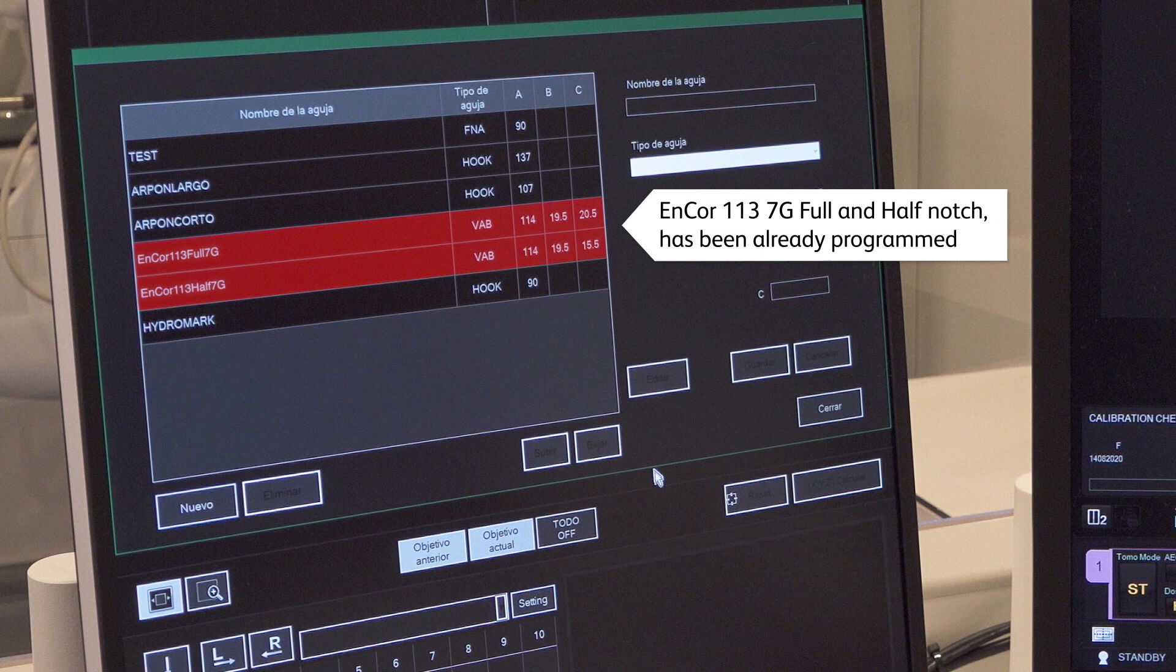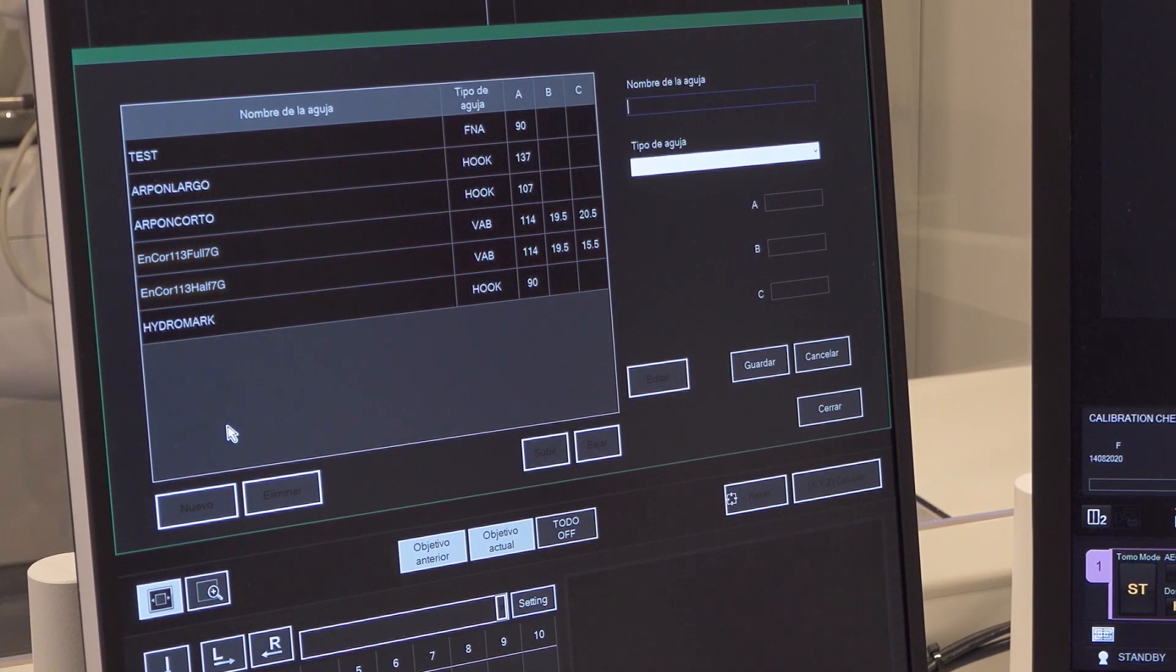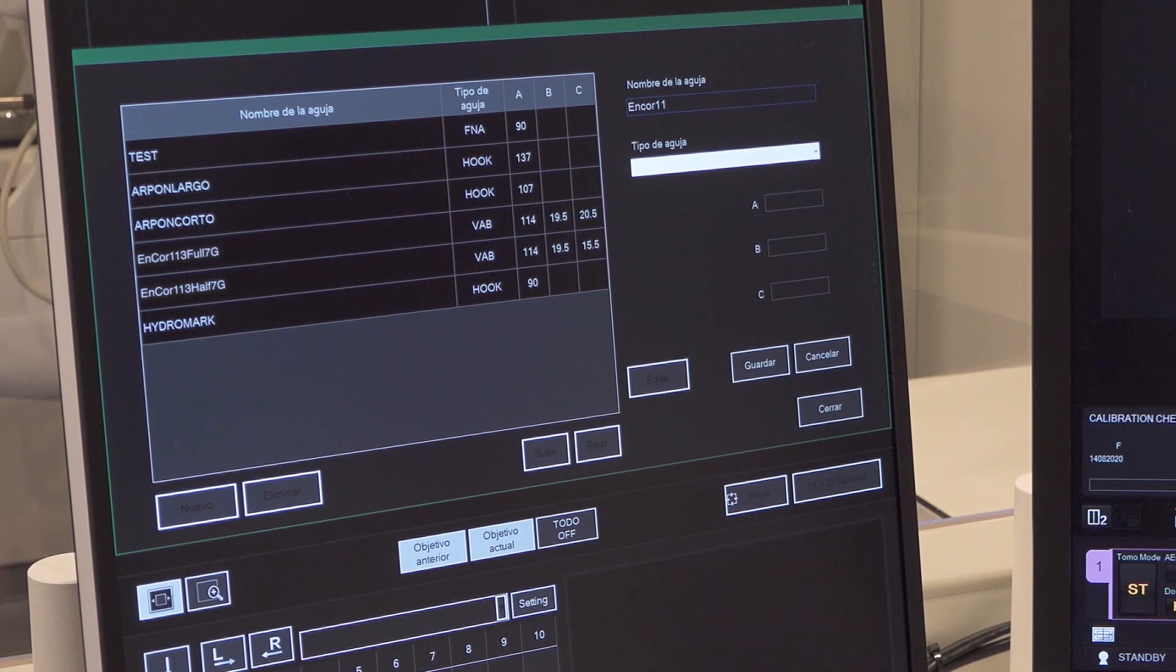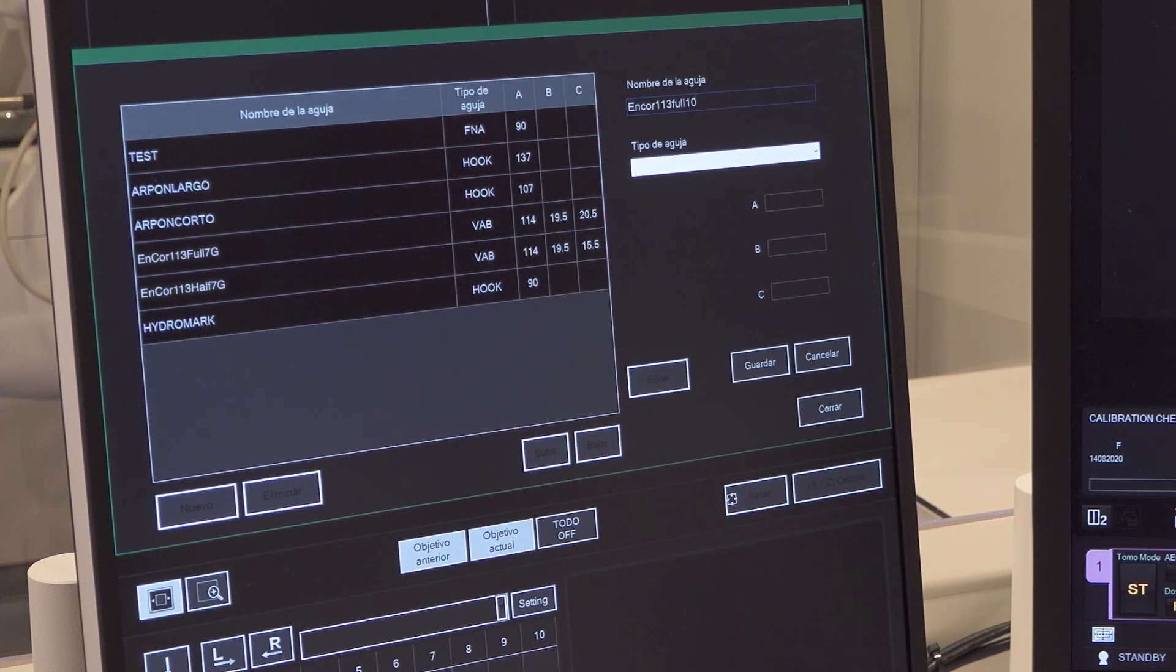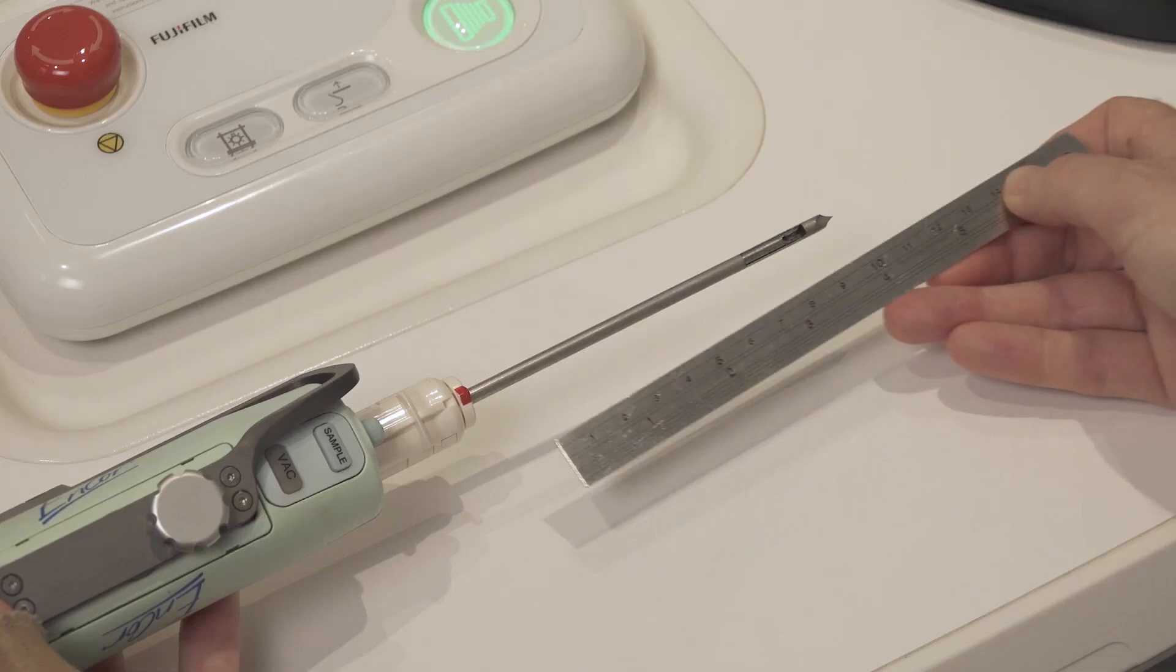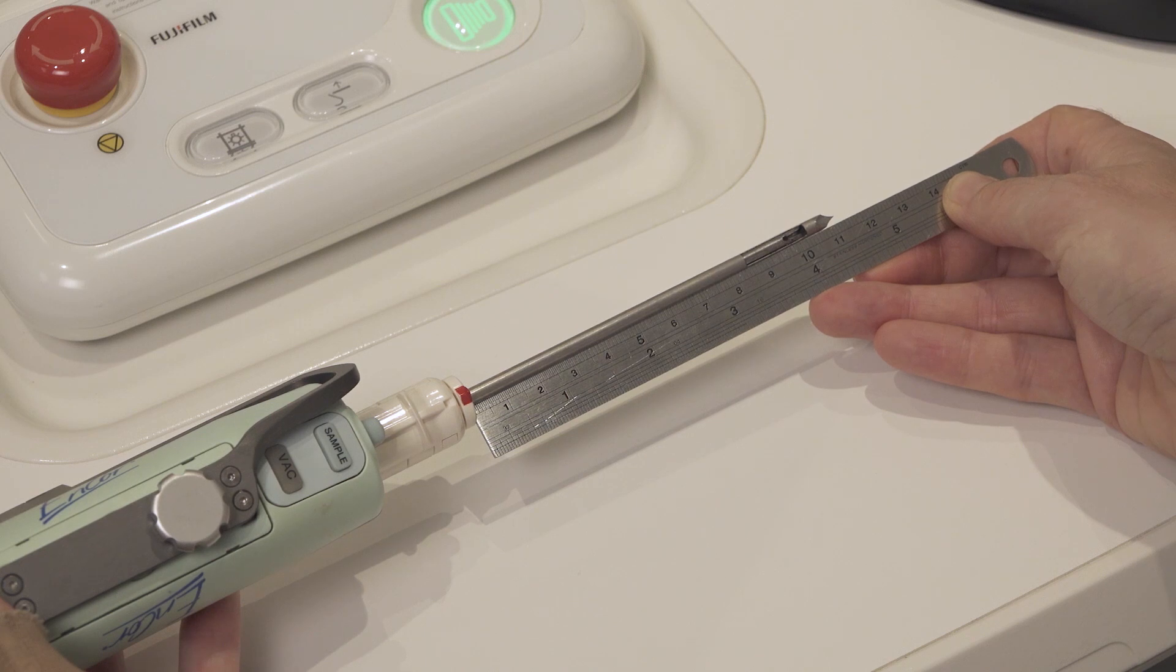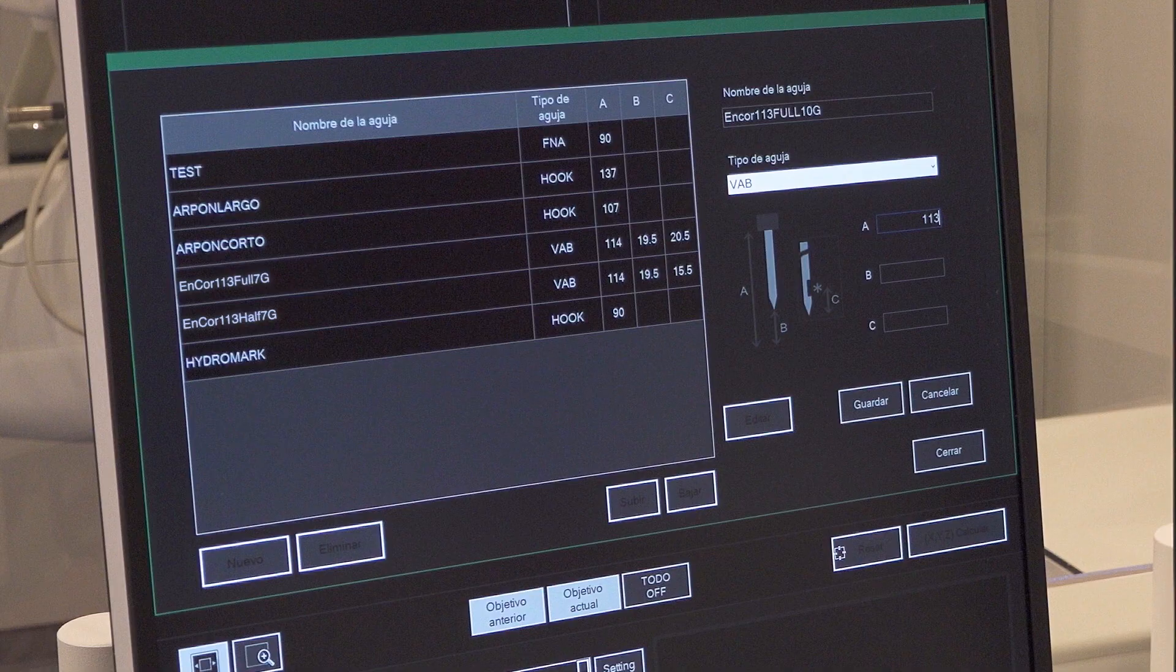Adding a new needle. Steps to follow: Click on New to add an Encore 113mm 10G full-notch needle. Three measurements must be done and values entered in the dedicated field. A: Total Needle Length.